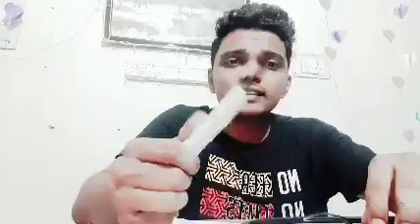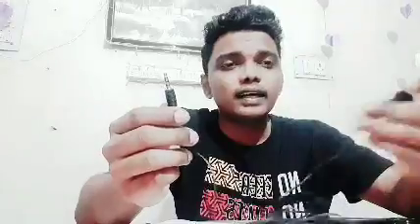You just need a stethoscope, a normal stethoscope. I have a Moripen, and that would work. And then you need this microphone. Then you need a cutter, and a pair of scissors. And this microphone should have an audio jack at one end and the mic at another end.